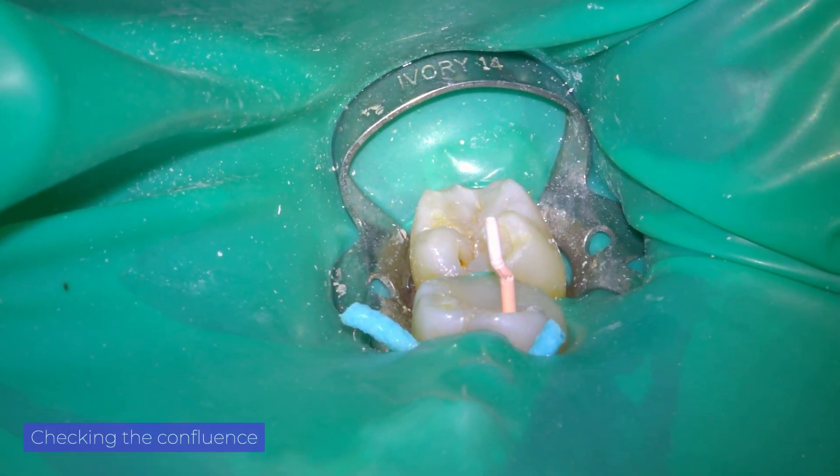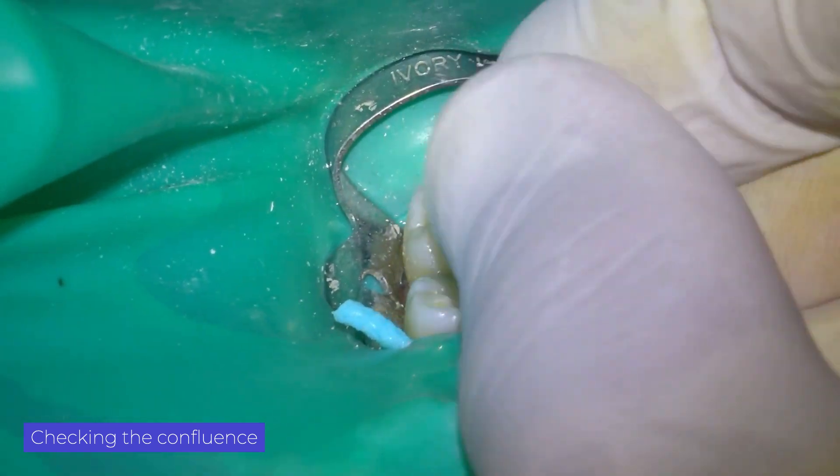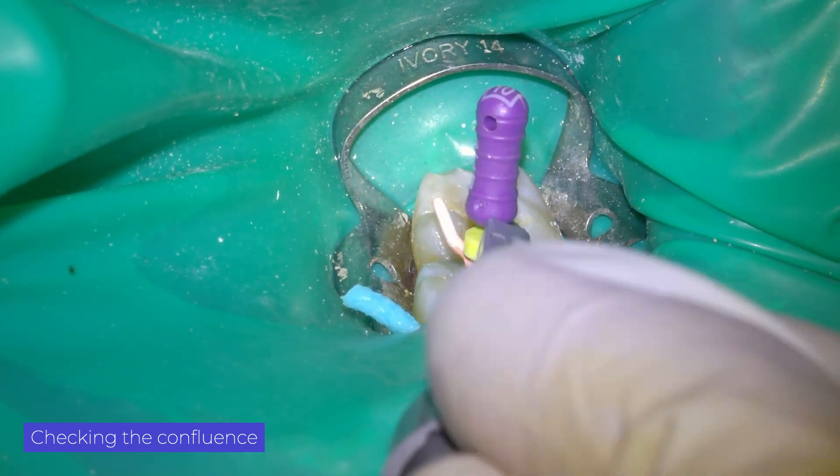With the cone technique and a low caliber file, we check the confluence and thus work the canal in a predictable manner, without the risk of over-instrumentation and transportation of the canal.